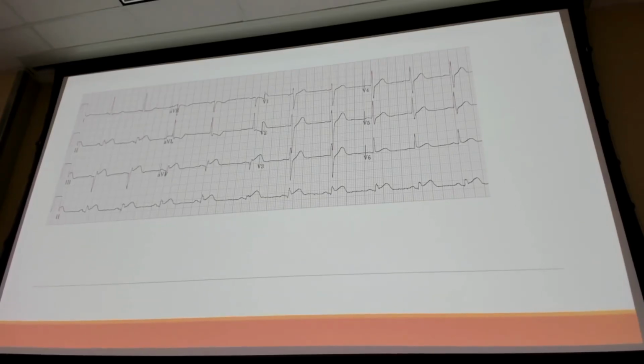And so, if you remember back to your EKG days in cardiology, what are we worried about when we have this inferior MI? What specific kind of EKG do we want to get? A right ventricular EKG for this one, yeah. And we'll go over some examples of what to look for with a posterior lead, and hopefully we can make it easy to remember.